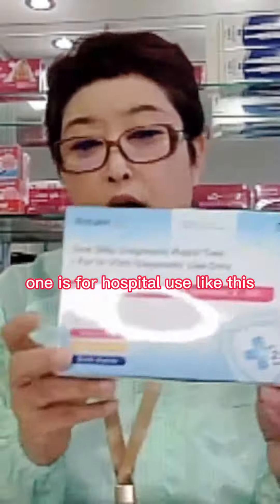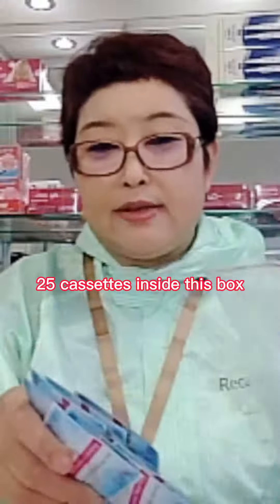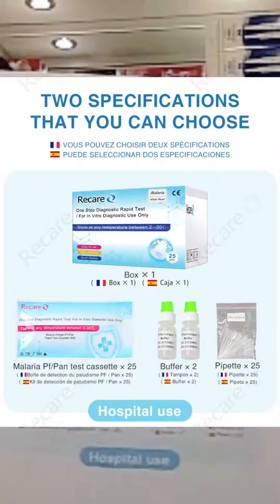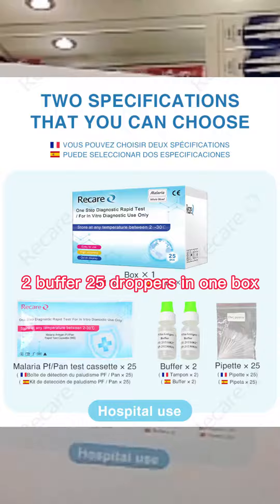One is for hospital use, like this. There are 25 cassettes inside this box and 25 droppers. This is for hospital use, for doctor use — 25 cassettes, two buffers, and 25 droppers in one box.